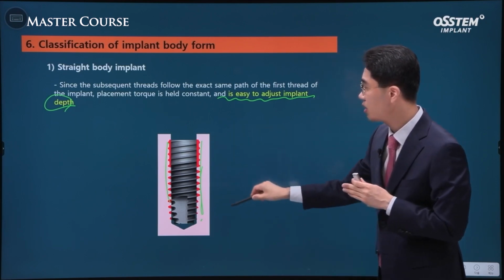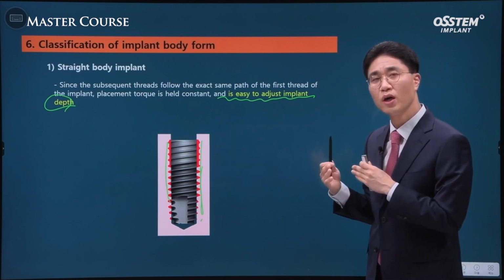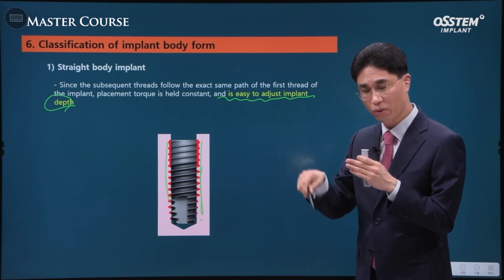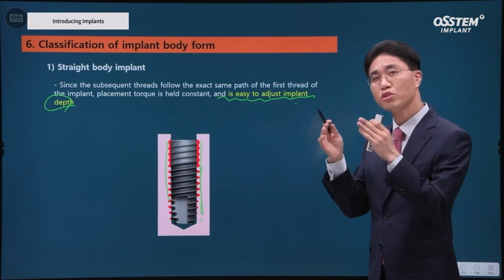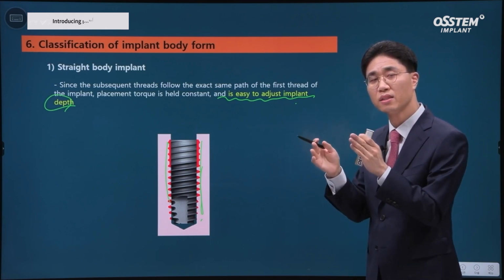Therefore, at times when we do drilling and place implant, we'd be able to avoid cases where depth adjustment is very difficult. In other words, the intended depth of the implant can be achieved.